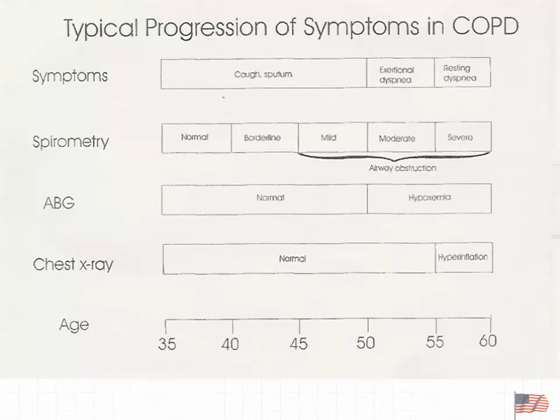The key part is that spirometry is the best thing to look at. Blood gases actually are crappy to use as an index of the severity of an asthmatic attack. That's why we need a quantified value like peak flow or FEV1, which is the ideal.